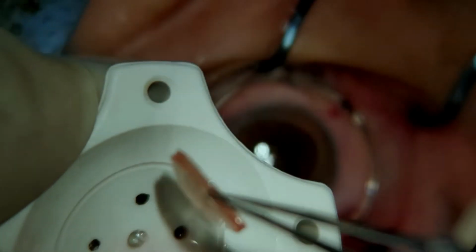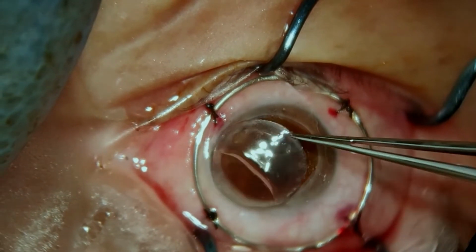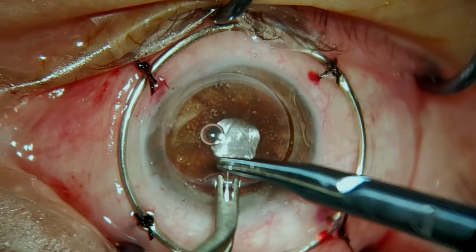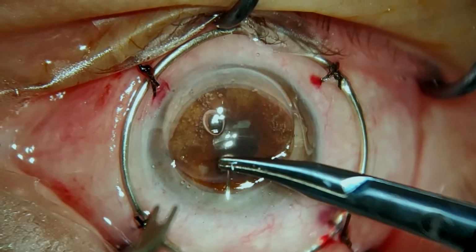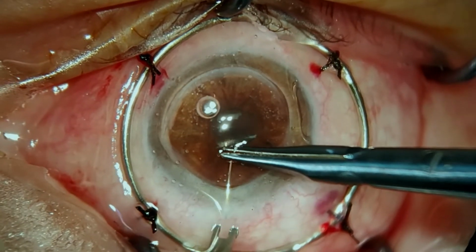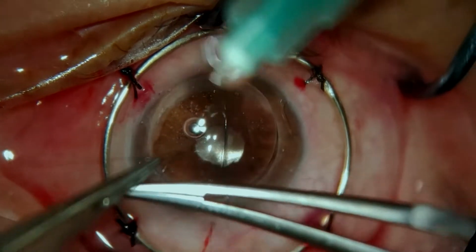Now the cornea has been cut, and we lay it on the surface on a bed of viscoelastic. It's important to place viscoelastic all over in the AC and on the corneal rim, because most of the time your cornea is going to be rubbing against the peripheral rim of the host. So you want to have viscoelastic on that side as well.